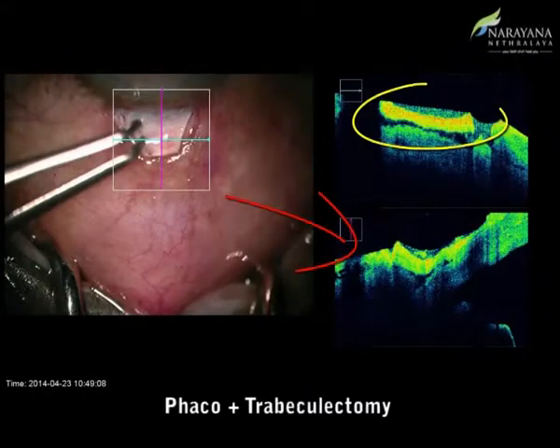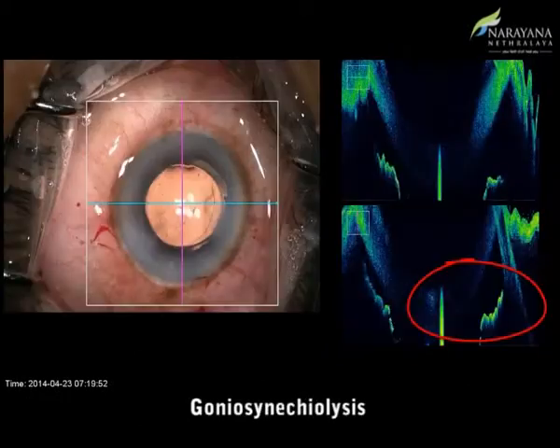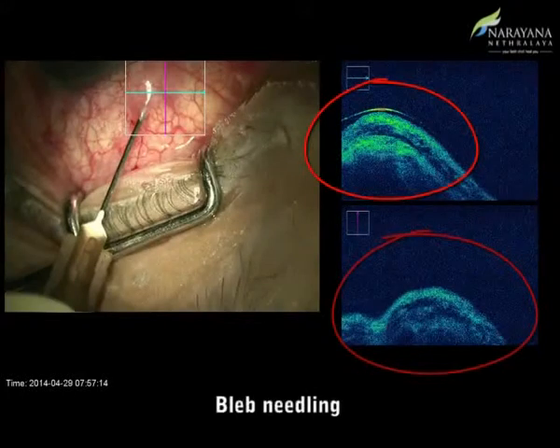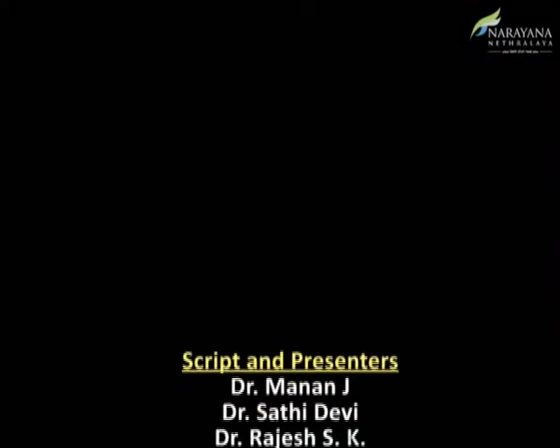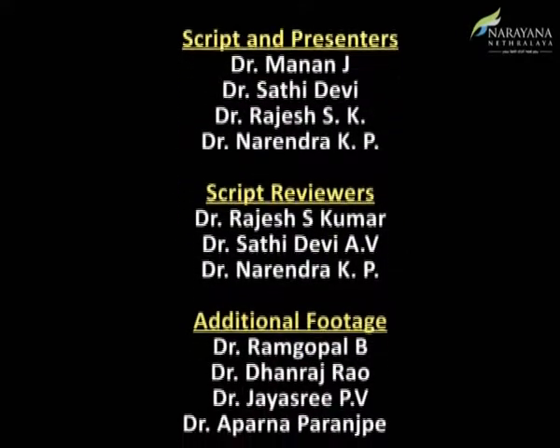We would like to conclude by saying that the IOCT integrated surgical tool appears to have a promising role as an adjunct in glaucoma surgery. This adds an extra dimension for the surgeon and could potentially develop into a good teaching tool. Further improvements in resolution and development of surgical instruments that would allow unhindered visualization of the regions of interest might make this an indispensable tool in intraocular surgery.